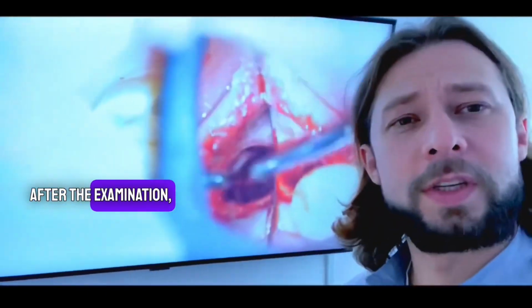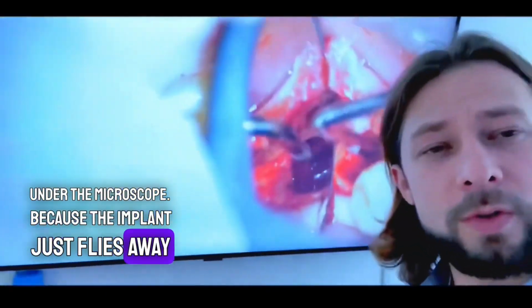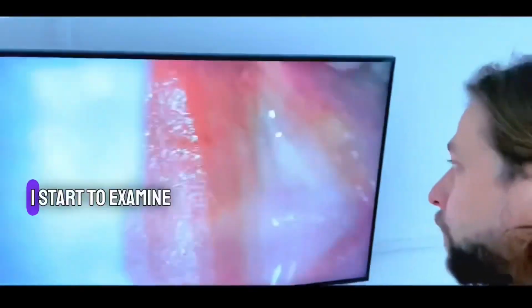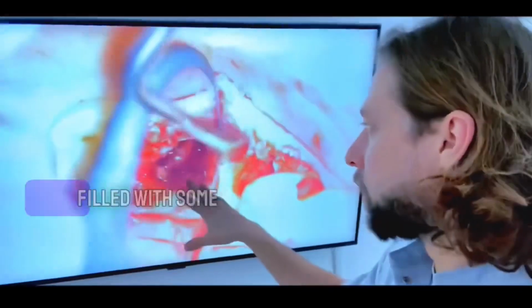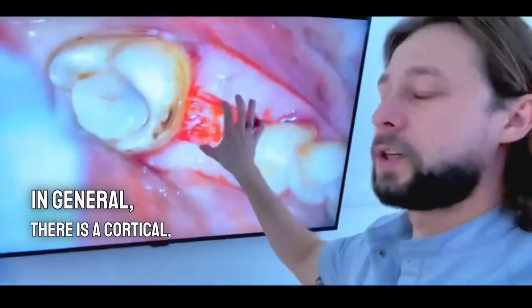After the examination, I decide to look at the whole thing under the microscope because the implant just flies away and dangles. I understand that there is a very large cavity in which it just twirls. I start to examine it through a microscope. And what do I see? I see a giant cavity filled with fibrous tissue, filled with some remains of either a cyst or something. In general, there is a cortical, and then there is emptiness.